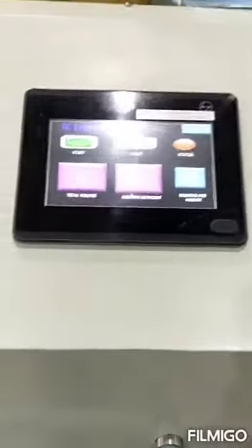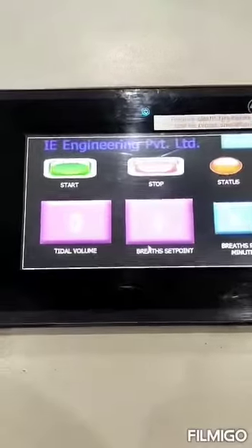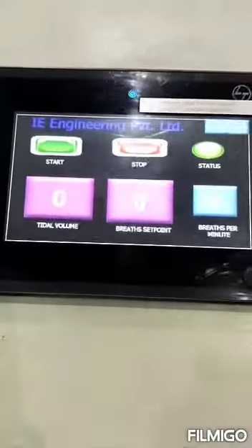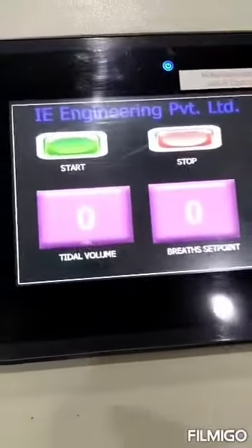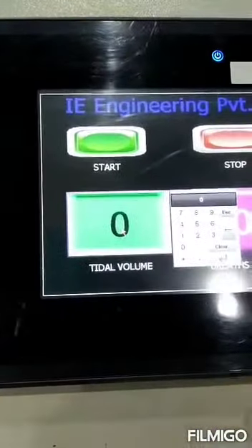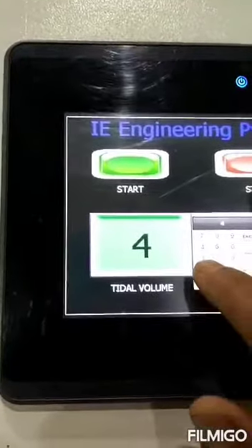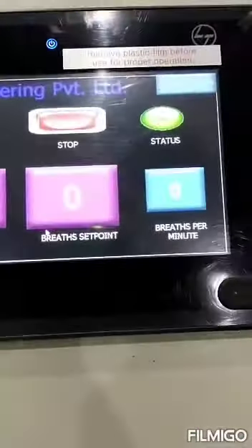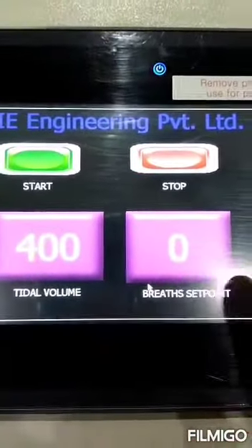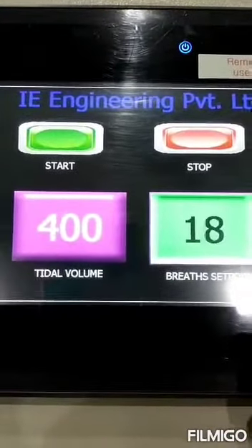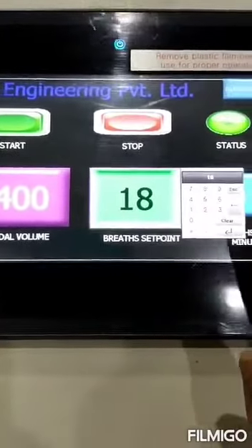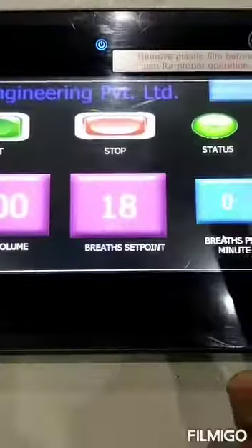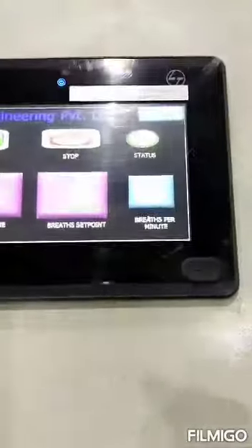We would like to introduce our ventilator. Here is the digital display. After starting, we have to set the tidal volume as per the patient's requirement. After setting the tidal volume, we have to set the breaths set point as per the patient requirement — about 80.